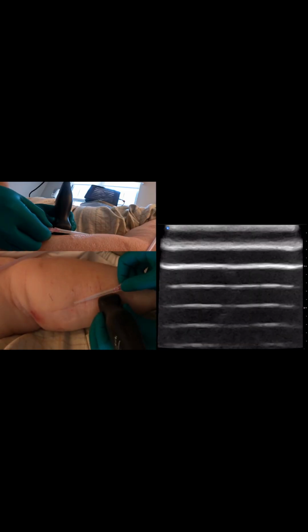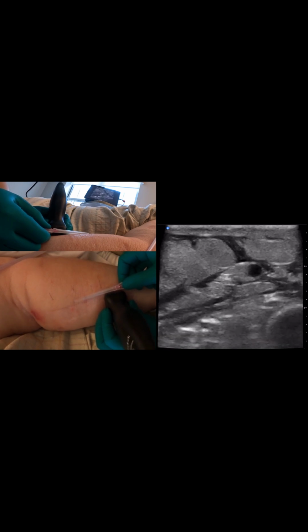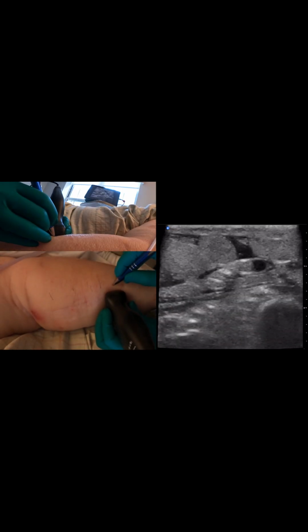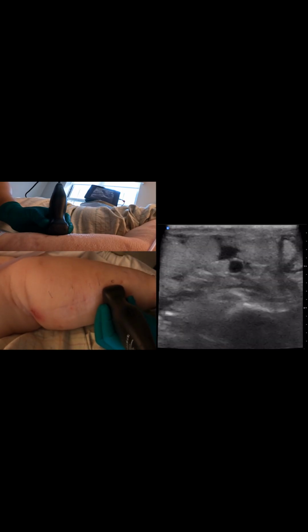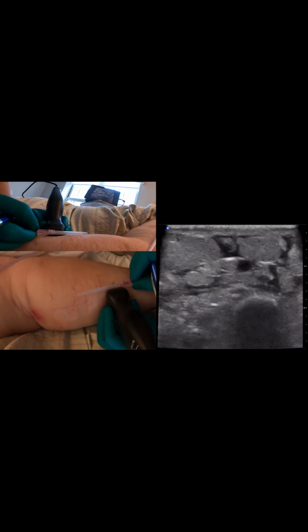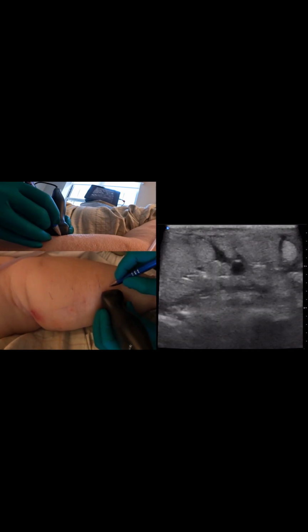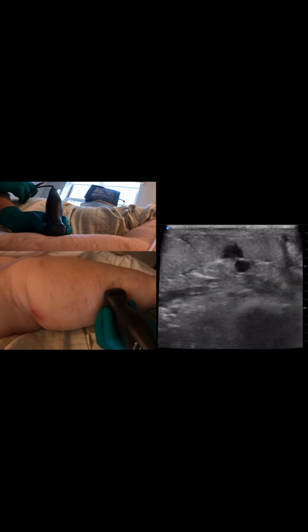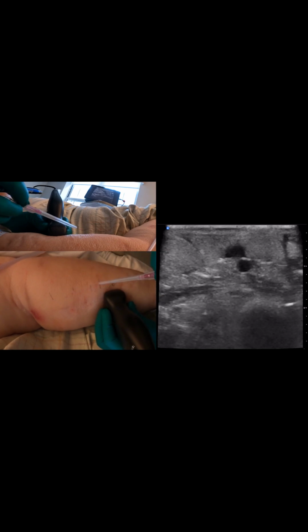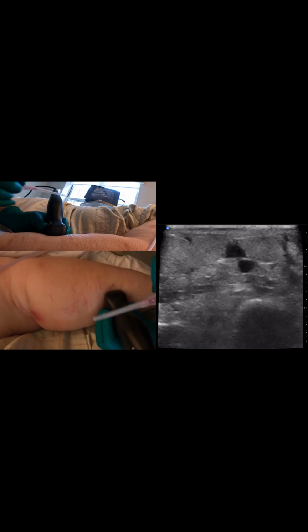So if I want to end here, I'll have to insert at about this point. That'll be my level of insertion here. That way we make sure the tip terminates post first. It's probably closer up here. That second one up there. Yeah, that one will get us past the valve here, these two valves, and it'll get us right before that valve. So we're going to try to settle the catheter here right in between.